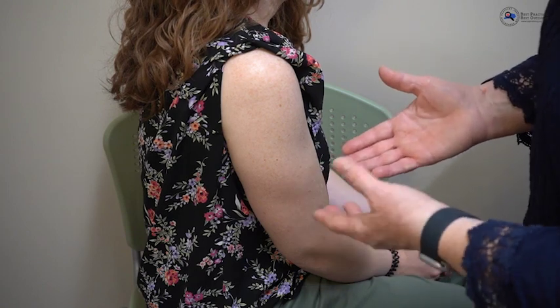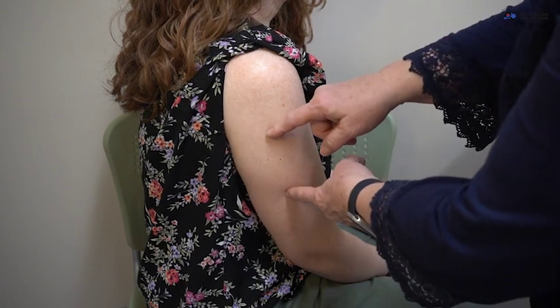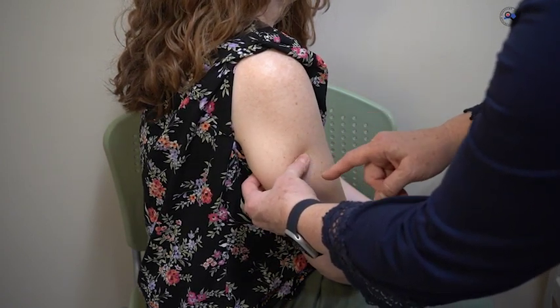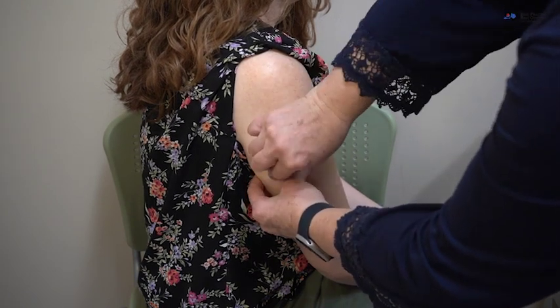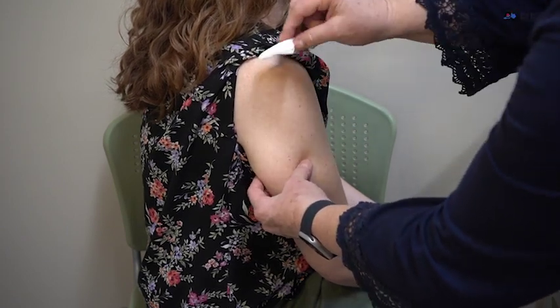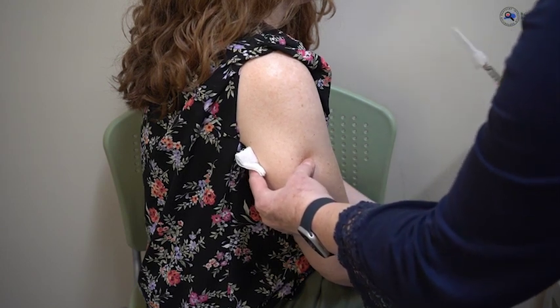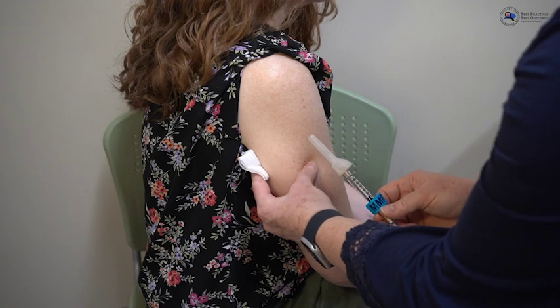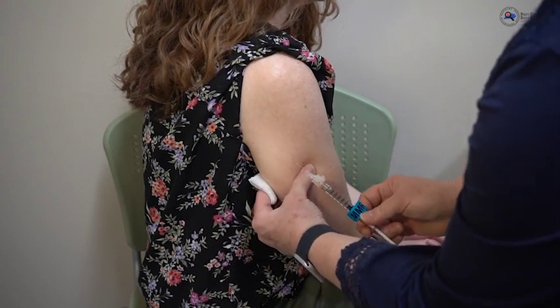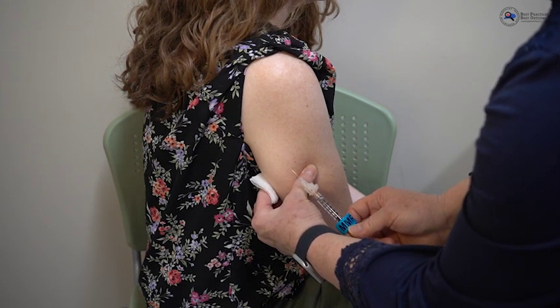When ready for administration, make sure your hands are clean. MMR is given subcutaneously, generally in the middle third of the upper arm. Identify the area and give it a pinch, pulling the sub-Q tissue away from the muscle. Have your alcohol swab readily available to disinfect the area, and keep a sterile 2x2 available in case there is a little blood or vaccine leakage. Verify your labeled syringe for time and dose. You will inject at a 45-degree angle — not 90 degrees — making sure not to contaminate the needle.